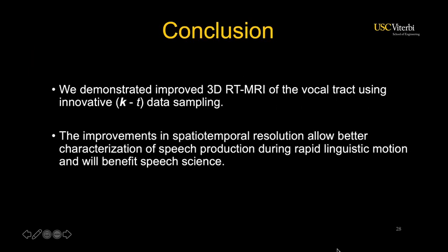To conclude, we demonstrated improved 3D real-time MRI of the vocal tract using innovative KT data sampling. The improvements in the spatial temporal resolution allow better characterization of speech production during rapid linguistic motion, and we believe it will benefit speech science.